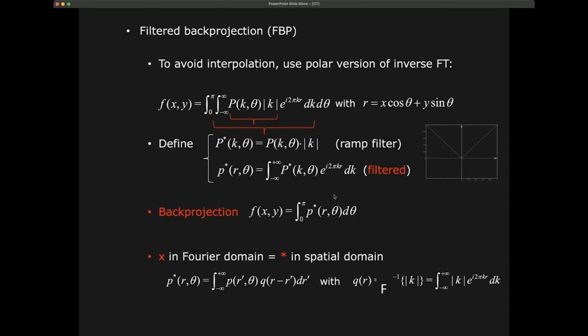And so there are actually ways to avoid this, and one way is using filtered back projections. Again, the theory is not the most important, but if we filter the Fourier domain of the projections first, then we can calculate this much more efficiently.